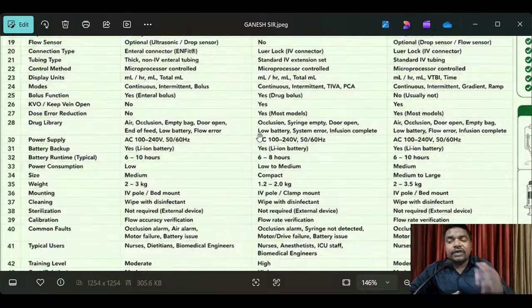As per the schedule we have fixed, the rate per hour, this much dose and this much nutrition should reach the patient. The doctor gives these instructions based on the surgery for the patient's recovery. These things are important to take seriously and implement in the work area. I hope you are getting my voice.